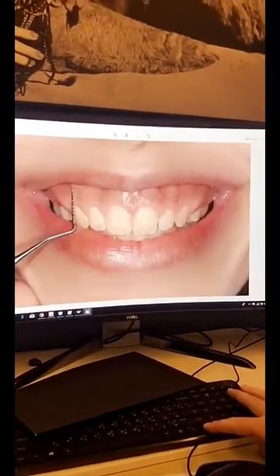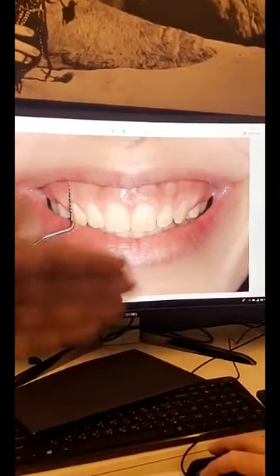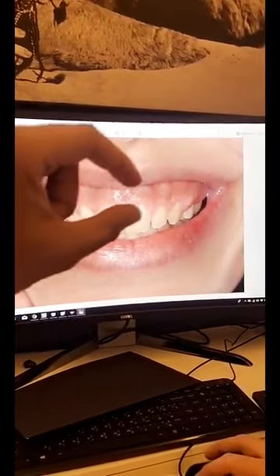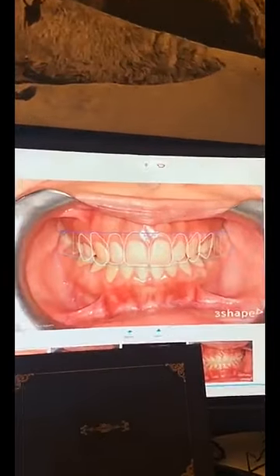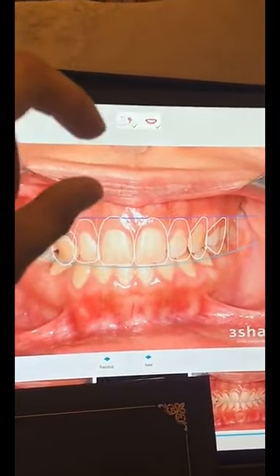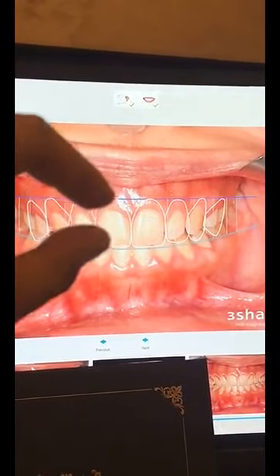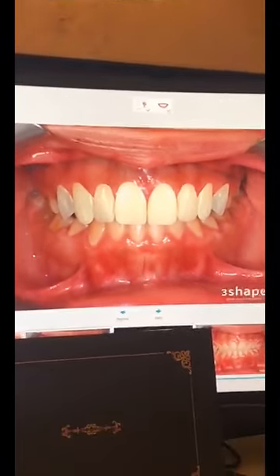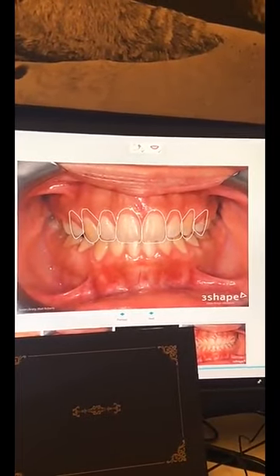In order to get to that level of proper clinical crown height, we have to perform certain surgical procedures, but these surgical procedures need to be guided by proper measurements of how much gingiva needs to be removed. As we mentioned, this surgery needs to be guided, and from such a digital implication, we can precisely know exactly how much gingiva needs to be removed in order to give a digital representation or superimposition of the proposed gingival display after the surgical procedure is completed.